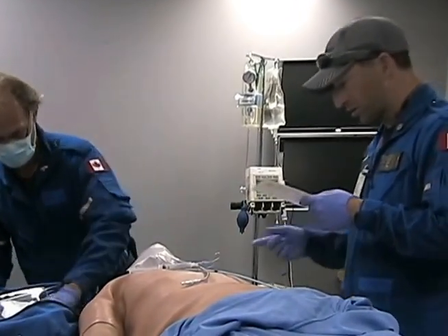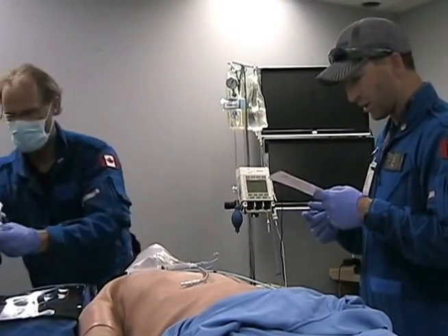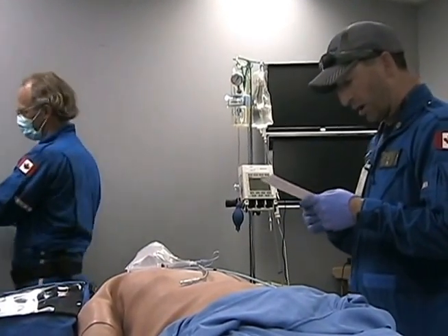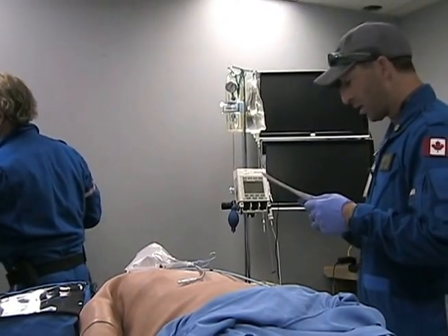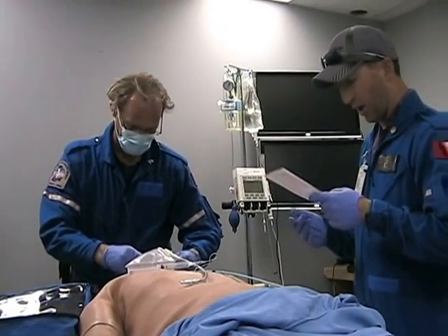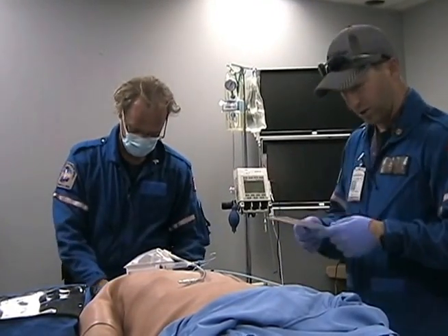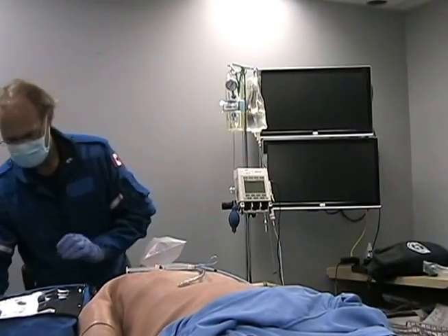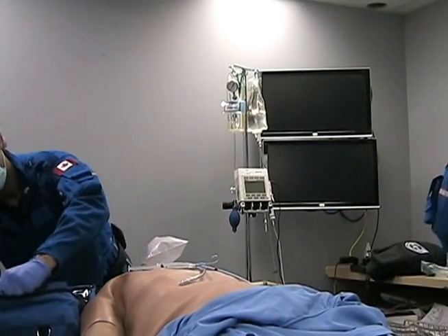Spinal motion restriction, it is going to have a collar. Assign someone to call out sats, thresholds, SpO2, I can do that. Plan A, B, and C, failed airway plan. I guess we'll just use an LMA. And post-intubation management, yeah, we can just give him some fentanyl. We're good, Scott. I think we're good. Yeah, just hold on a sec here, I'm not quite ready yet. Okay, checklist is good though.